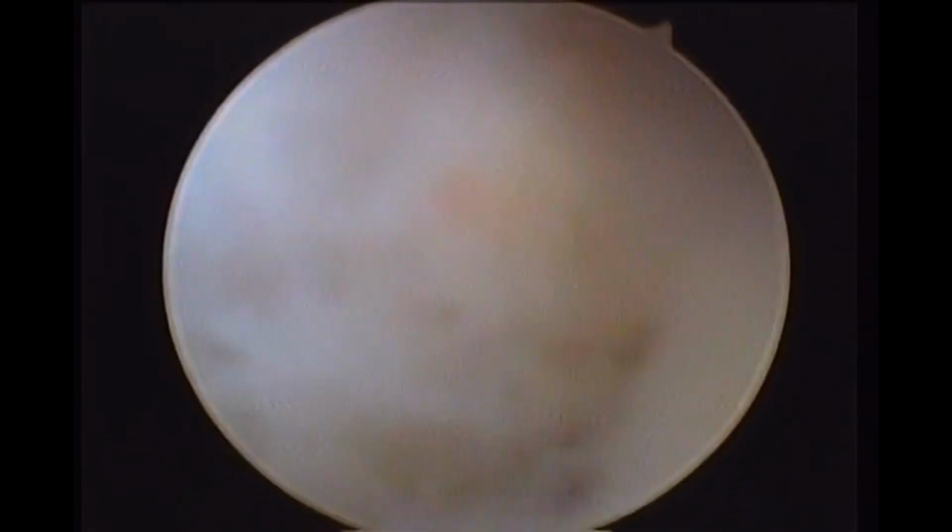At this moment, you are like driving in the fog or driving in the darkness. So people ask me, Osama, how can we know that we are pushing in the correct direction? It's all down to the feedback resistance to your hand. If you're going through the muscles, it's different than going through adhesions, different than going into the normal track. So push slowly, get the feedback, and climb up in the proper direction using the fluid push and a gentle push by your fingers.